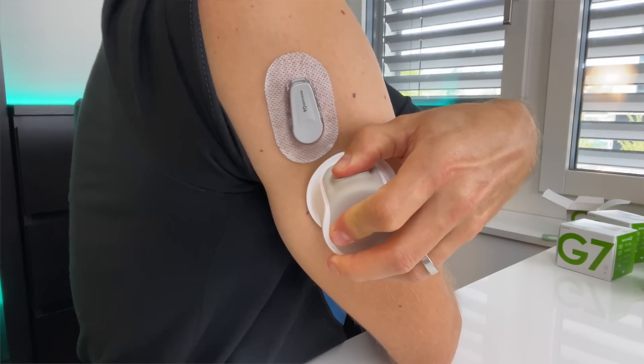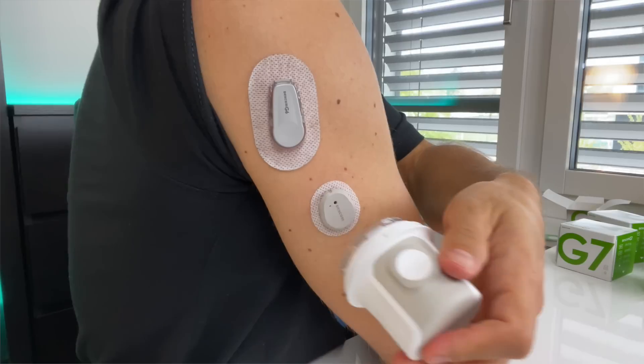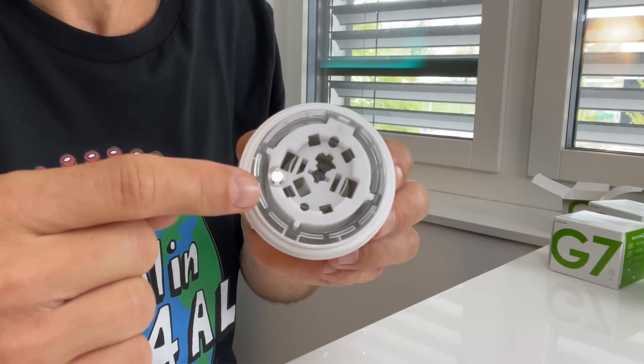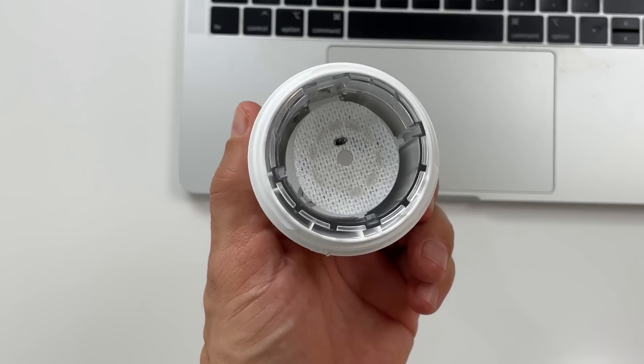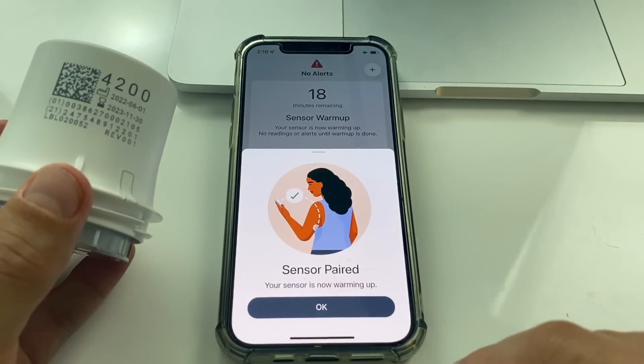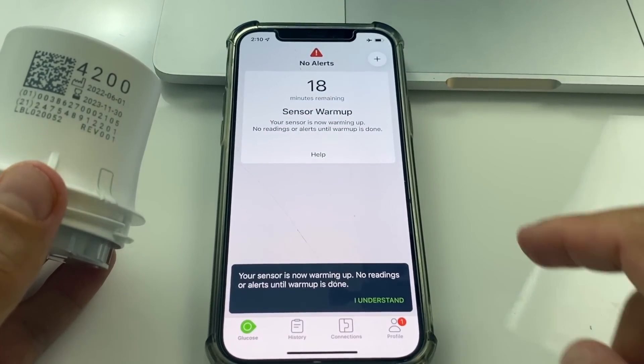As soon as you physically apply a new G7 sensor, the 30-minute warm-up starts automatically. There is a tiny magnet in each applicator and a similar magnet built into each sensor — when you apply the sensor the magnets get separated, and as soon as they separate, the timer starts ticking. I applied the new sensor several minutes ago, and when I initiate the sensor in the app it only shows 17 minutes because 13 minutes already passed. You can apply a new G7 sensor while your current sensor is still running, so when the old sensor ends you switch seamlessly with no gap in the graph.